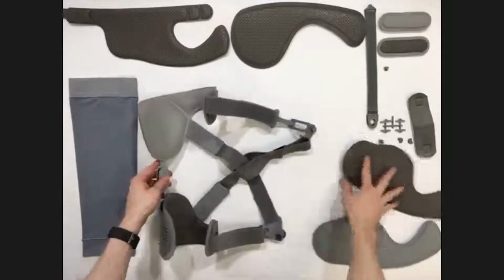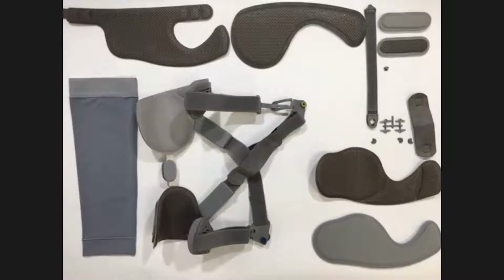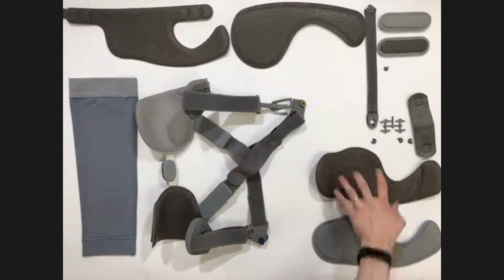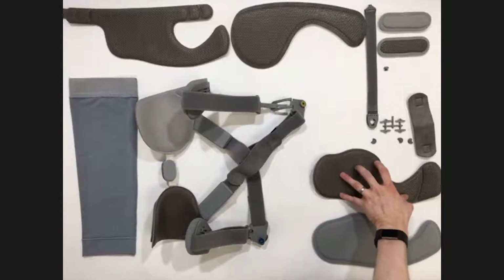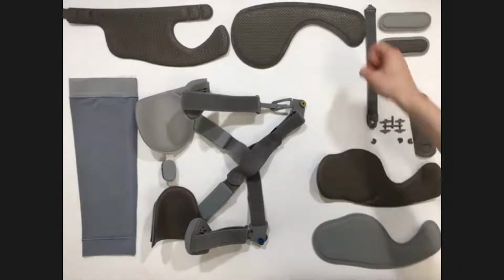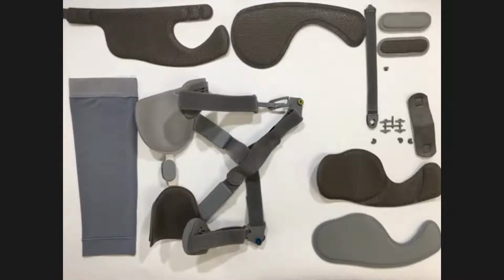So looking at the different liners that we have, there are different ones for the tibia. So looking at the bottom, we have a doe skin liner, exactly the same as the one we have on the thigh. We also have the original Sensil silicone one. And looking at the thigh liners, we also have full Sensil silicone ones as well. So if that's something that you wanted, you can actually replace these liners with those.